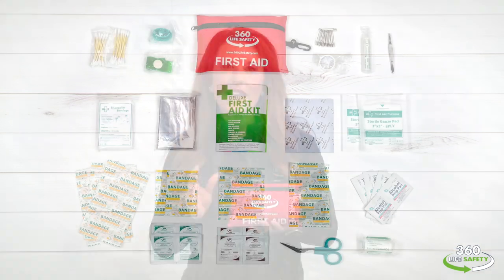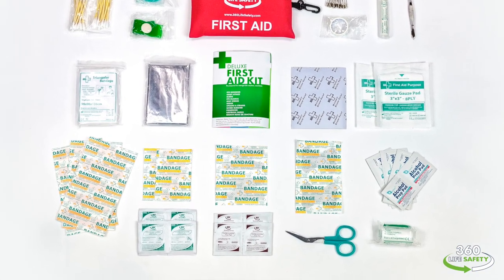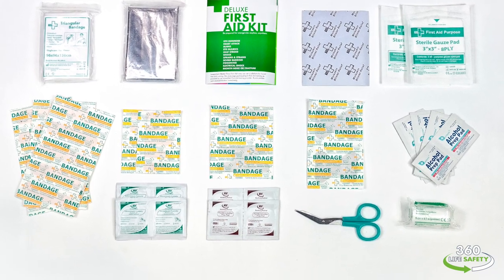It does have 92 pieces in it. It's a little bit of a step above the First Aid Kits you might be used to. It's of course going to have an assortment of band-aids, antiseptic wipes, ointments, and a pair of scissors that you're used to seeing in a First Aid Kit.